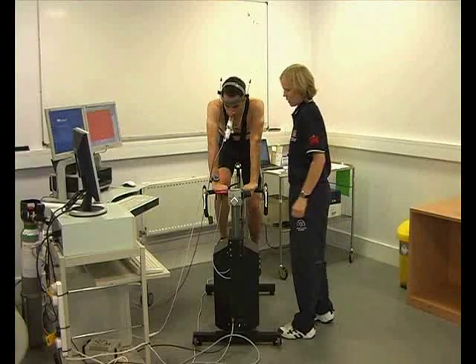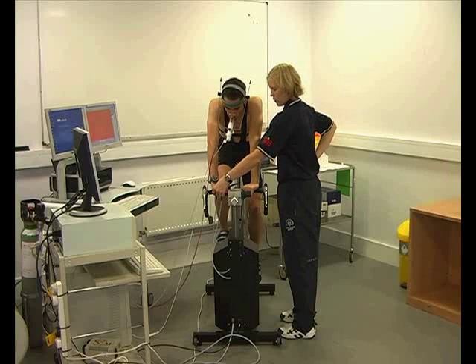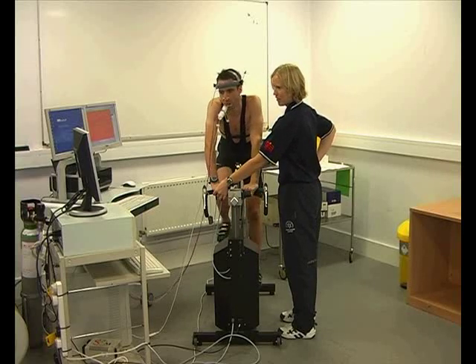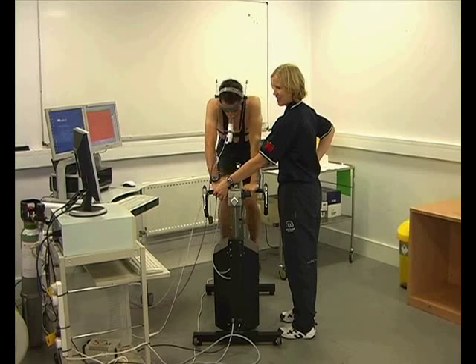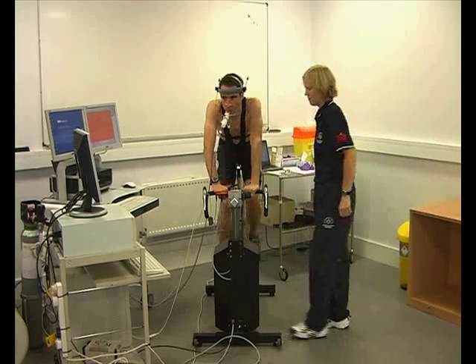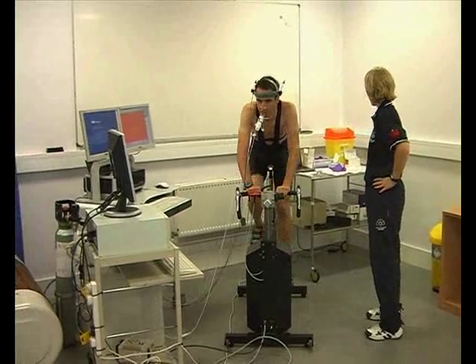Here we are at the beginning of the test. The athlete wearing the mouthpiece is ready to go. Press the SRM box just to record the file, and the athlete picks up the cadence, overcoming the somewhat heavy resistance at the beginning — but it's fine once the flywheel gets spinning.